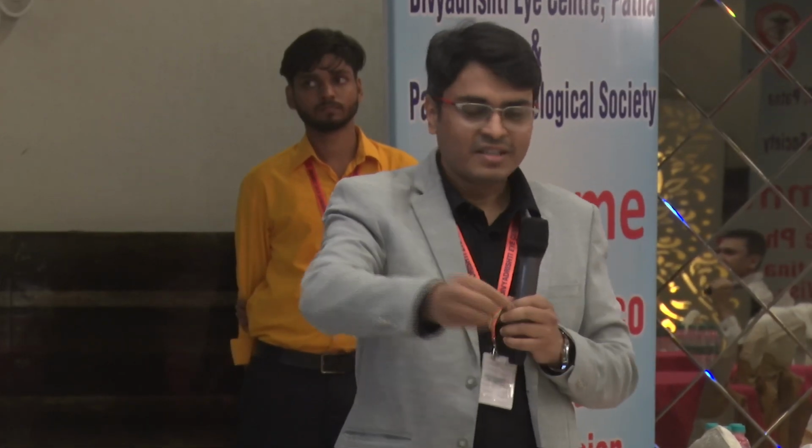If the bleeding doesn't control, oil and other things I consider very late. And I think we shouldn't put oil just to control the bleeding. I think if you just put gas, sometimes what we have seen in PDR cases, if there's a lot of bleeding, you can put in C3F8 gas and leave it for 2-3 days. The bleeding will stop, and you can retake up the patient after 2-3 days.